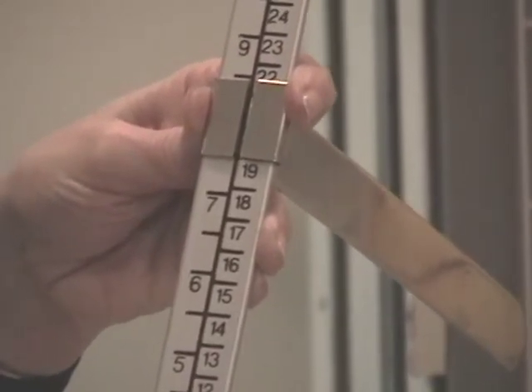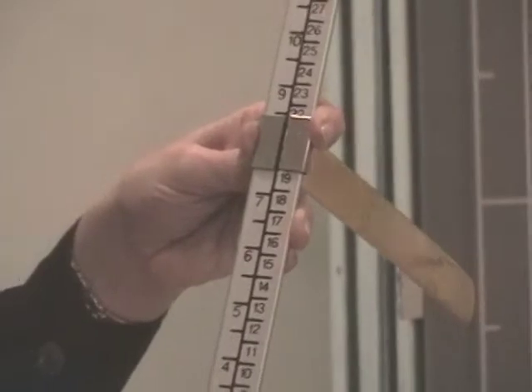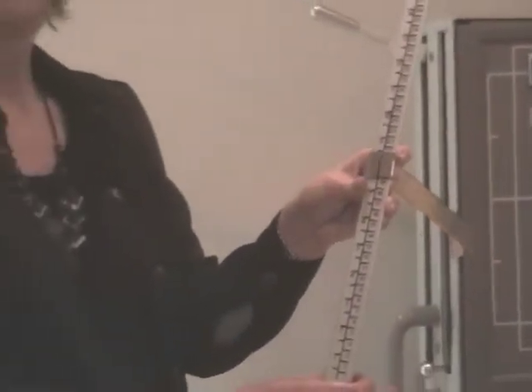Out by the X-ray exposure panel, there should be a technique chart. In the chart, you will find chest, you will look for a PA projection, and you will look for 19 centimeters. Most charts do not have odd numbers in their setup. Most charts go with 14, 16, 18, 20. Andrea is young and she's in good physical shape, so I'm going to take the 19 and round it up to 20. That tells me how big her chest is, what its depth is.